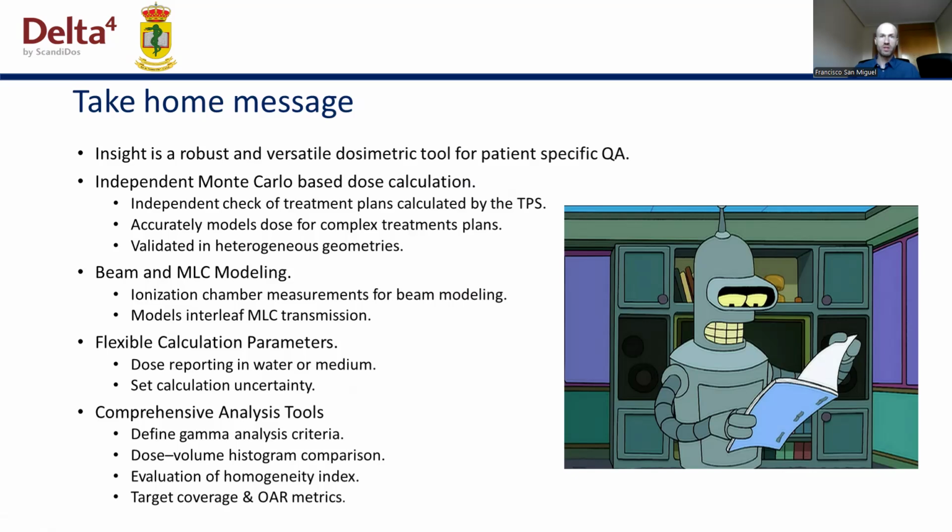It has been demonstrated that Insight accurately models the dose for complex treatments, including VMAT, IMRT, and 3D conformal plans. Additionally, the system has been validated in heterogeneous geometries. The modeling of treatment beams can be performed using the ionization chamber measurements used for the TPS, and this allows the model to be adapted to the specific linacs in our department.